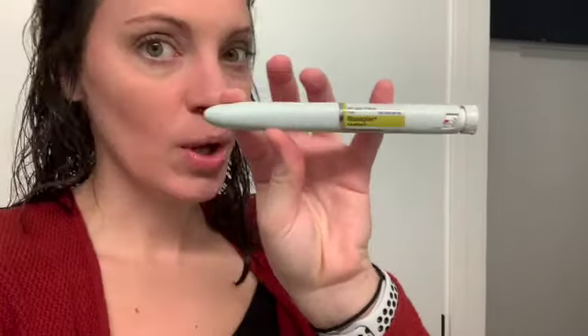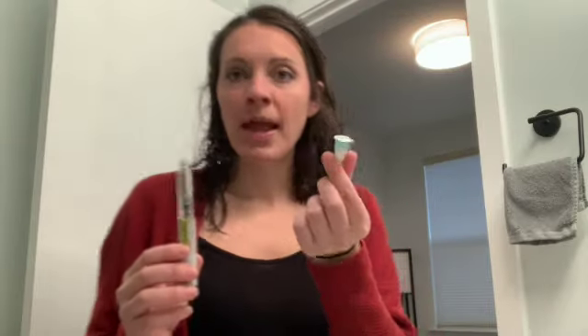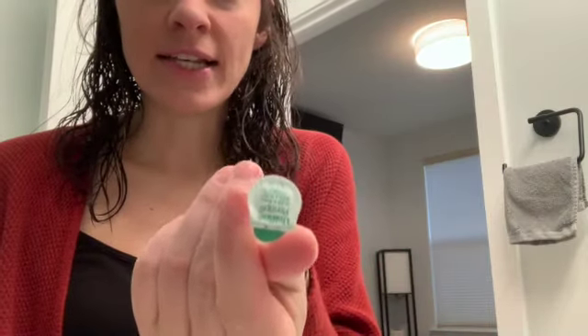I take eight units at 7 a.m. every morning and this is what it looks like. I'm going to put it in my arm. I have my pen here. You just take the lid off and then I grab a new needle. It is covered and protected, it's good to go. I just rip that off and put it directly on my pen.